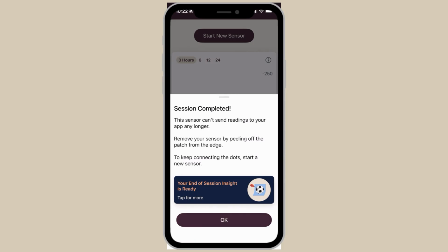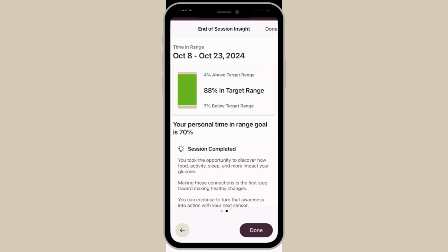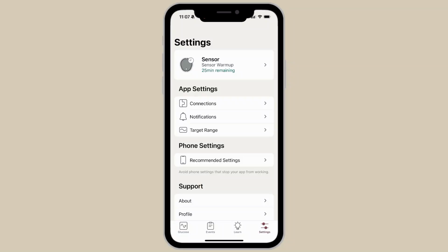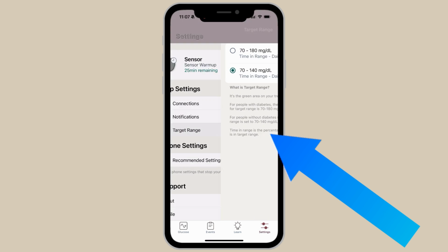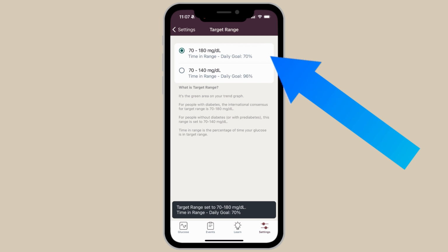The app will also send you an end of session notification after the 15 days, showing your average blood sugars and time in range. Time in range is an important value for us living with diabetes, and a lot of doctors now focus more on time in range than on A1C. Your time in range is a percentage that shows you how much of the time your blood sugars were within your blood sugar target range. You can set the target range in the Stelo app, and they recommend that people with diabetes choose the first one here and people without diabetes choose the tighter range.